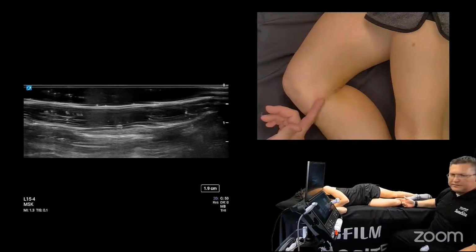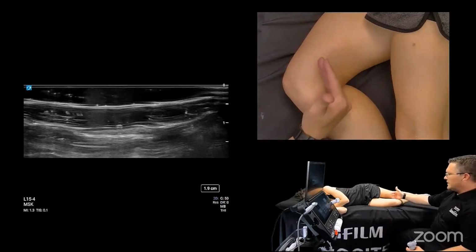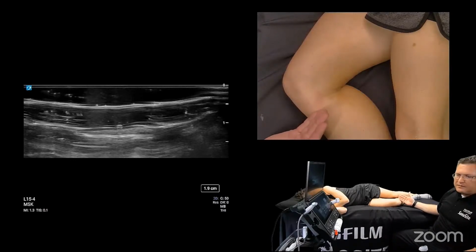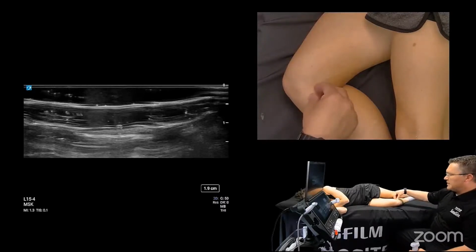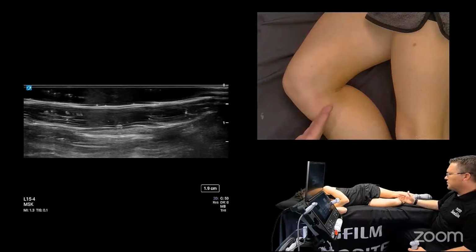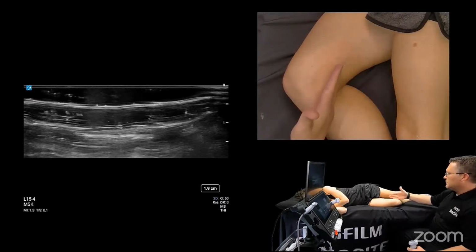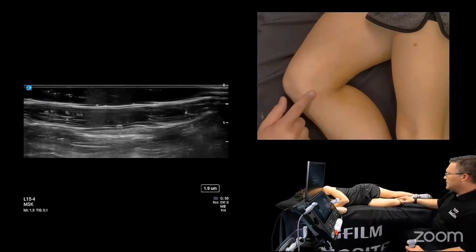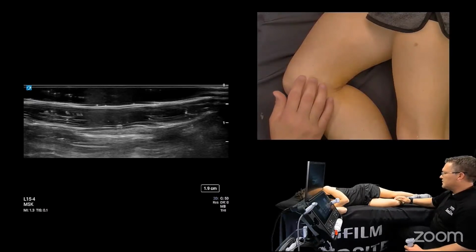And just anatomically speaking, when I visualize what the pes complex is doing here, I treat it a lot like the medial malleolus of the ankle. I think of the pes tendons wrapping around and taking a turn, kind of like a posterior tibialis tendon of the medial ankle, where the medial malleolus is just acting as this pivot point for a redirection and an added leverage to what we're trying to accomplish with the anatomy. So just imagine this shape. I'm not going to see any pes complex up here at the joint. I'm not going to see it any further distal. It's just right in that trough where I can feel the medial tibia. So palpating ahead of time, studying this anatomy is very important.